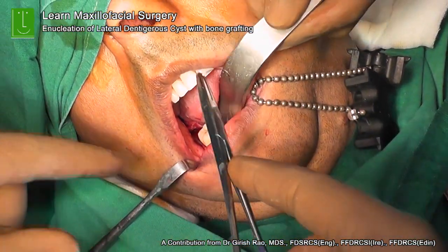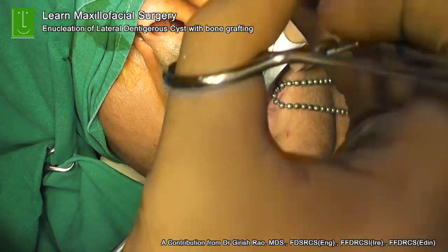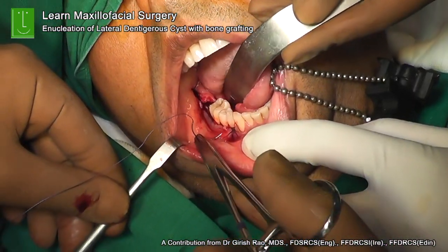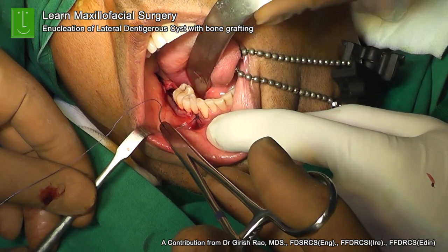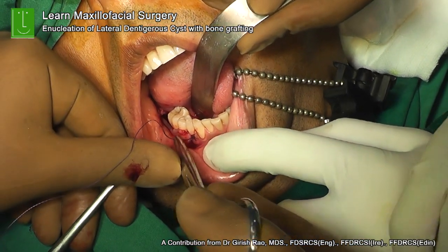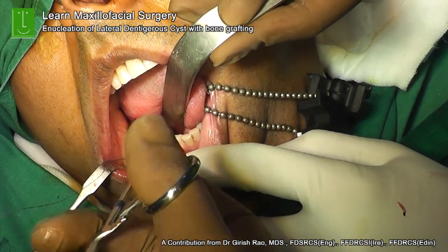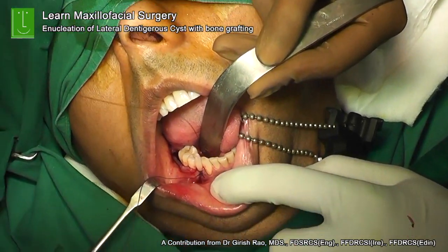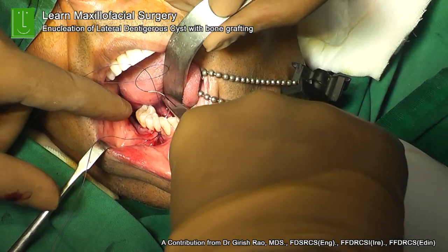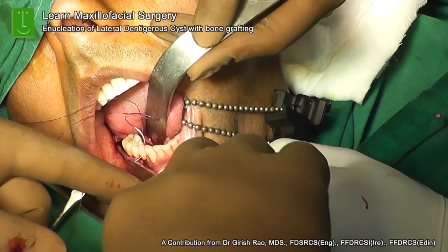Any simple suturing technique can be used. Here we're using an interdental technique to bring the flaps together. I like to use a combination of interdental, where the teeth are there, and in the partially edentulous area I like to put a horizontal mattress stitch. The advantage of putting a horizontal mattress stitch is the fact that you get bunching of the tissues and good approximation, good eversion of the tissues, and thereby the healing will be very, very good.